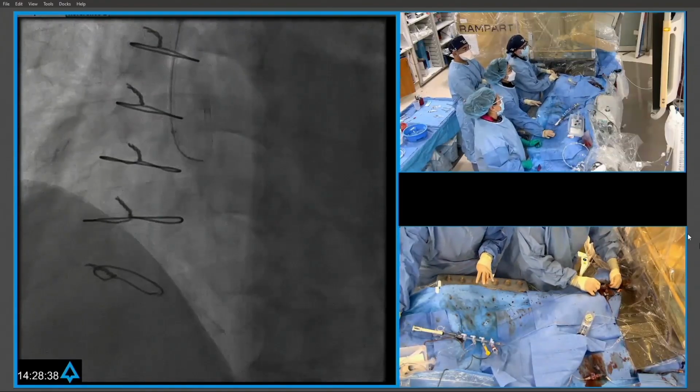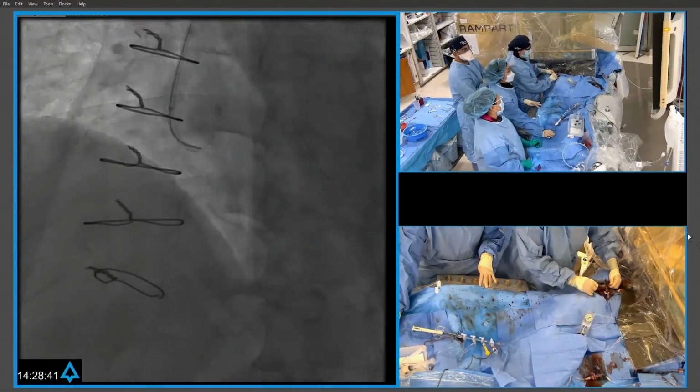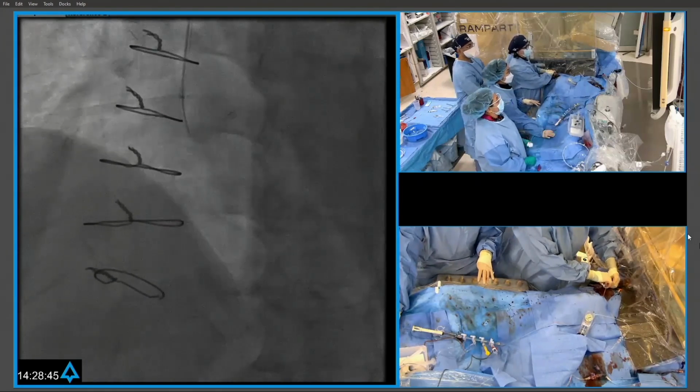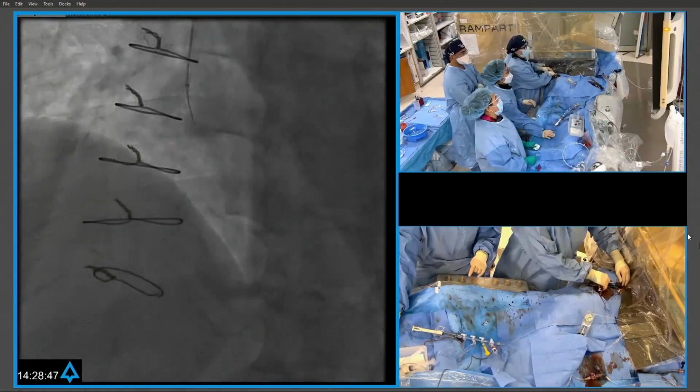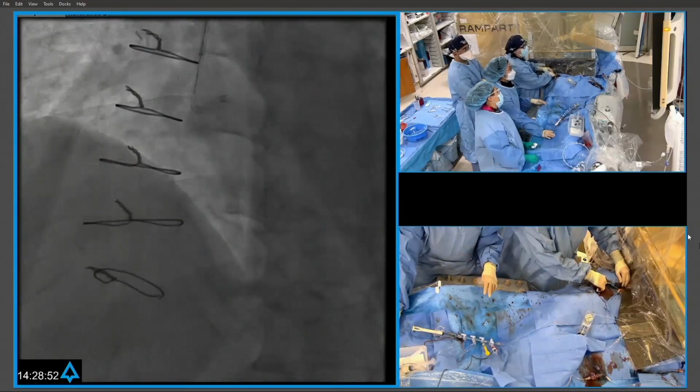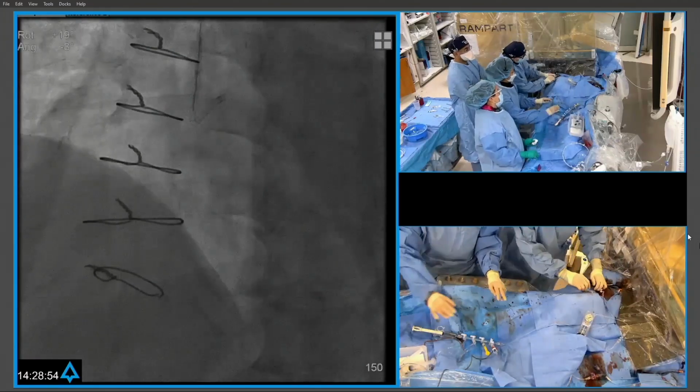And once we had that, then you can start with a soft hydrophilic wire. And so we typically, Margaret and I both, use Fielder XTA for that purpose. There are others who say, don't ever do that, just go straight with a Mongo or go straight with a Pilot. But I think the XTA is pretty reasonable, and you saw it made reasonable progress there.